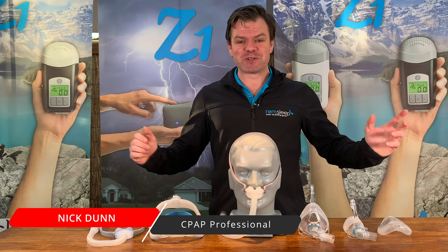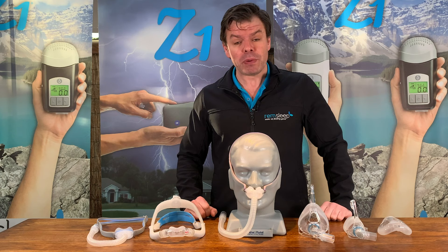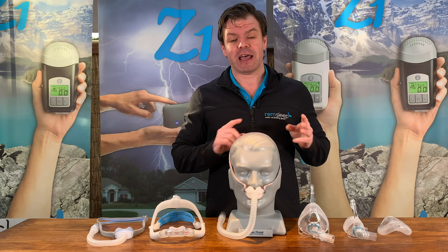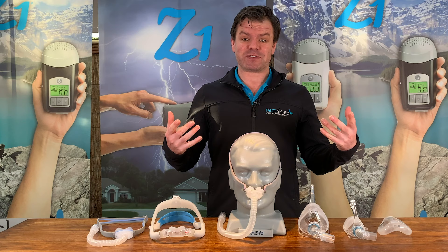When you first get diagnosed with sleep apnea and you're told you need a CPAP mask, it can be very, very confusing. There's just so much variety with the styles and all the manufacturers that it can be a little bit overwhelming. A few years back I did another video where I talked about the three main styles - the pillows, the nasal and the full face mask. But I thought it's time to do an updated video because there is new technology and new varieties of CPAP masks available.